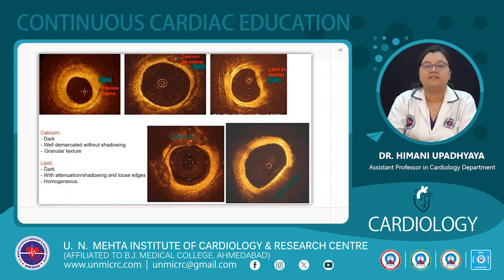Again, the first image is suggestive of a homogeneous high backscattering region of fibrous intima. In the second image we can see low backscattering and low attenuating calcium.